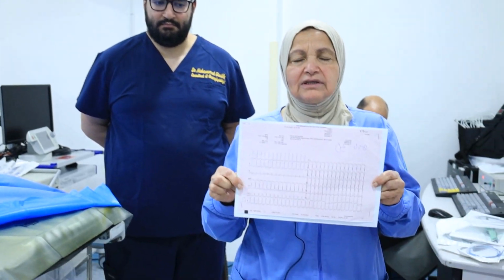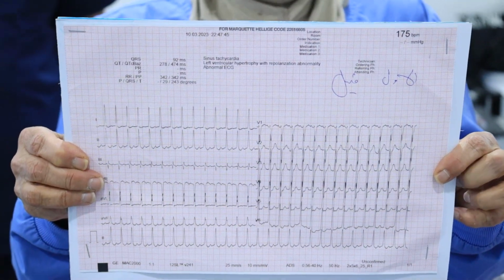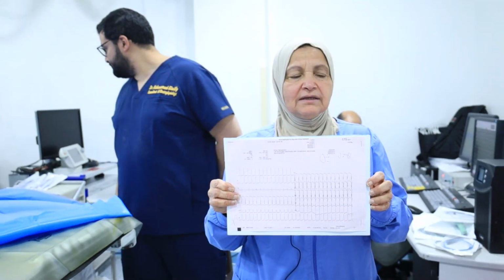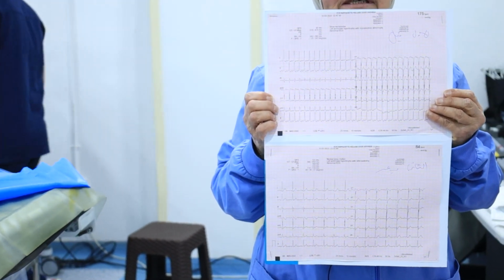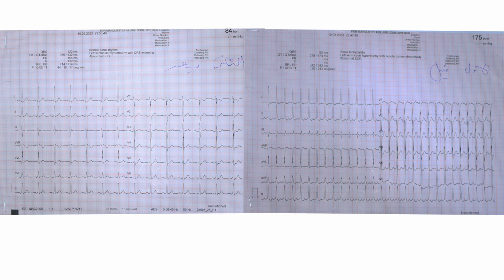Actually, this is the tachycardia documented, and as we can see, it is a narrow complex supraventricular tachycardia. This morning, when we were revising the case before admission to the cath lab, we compared both ECGs. As you can see in these ECGs, AVL shows a negative delta. Look at V1 in the resting ECG: there was an R wave. And look at the QRS complex all through the chest leads from V1 to V6: minimal pre-excitation.